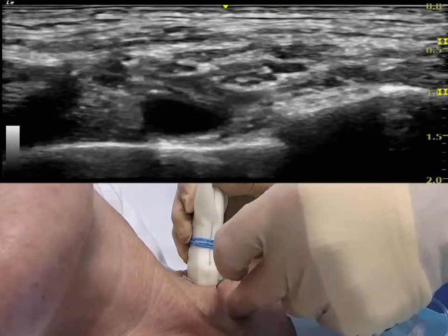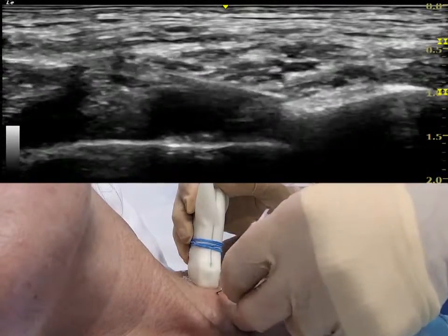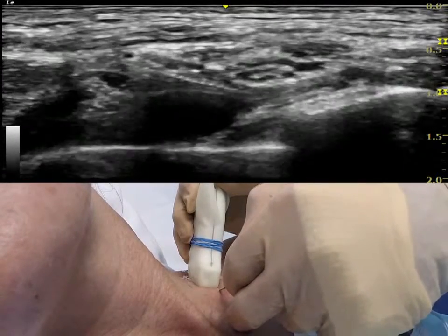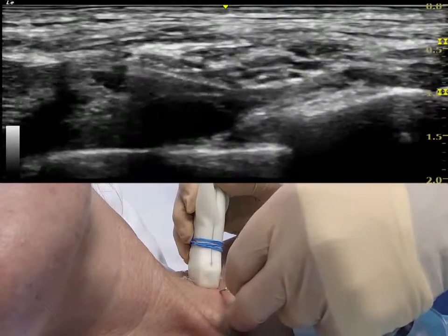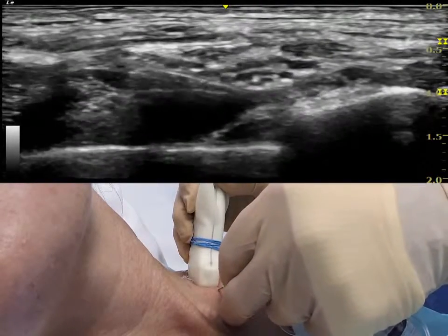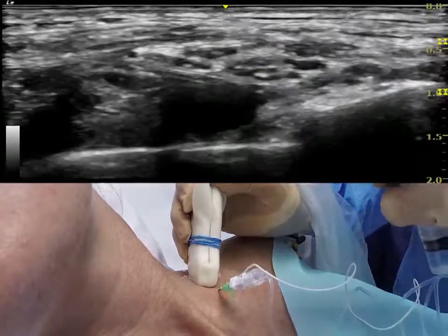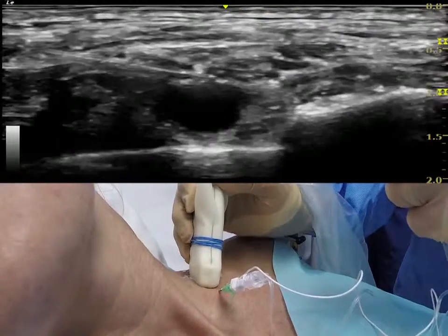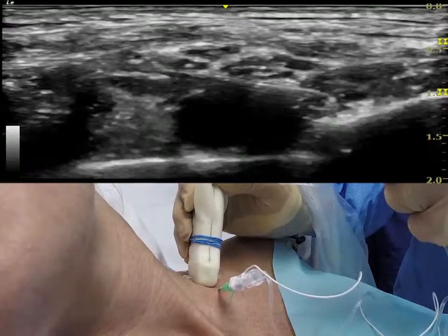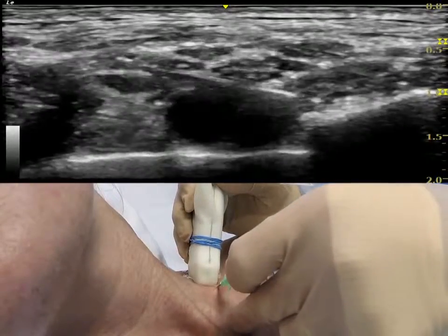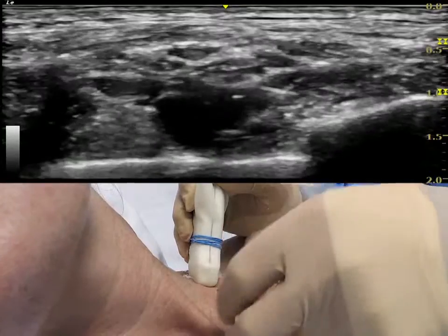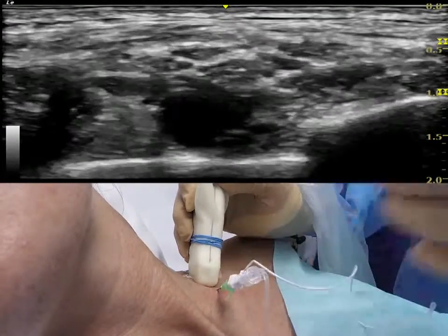The e-cath system makes the actual catheter insertion a very simple process. We can maintain the ultrasound image while the needle is withdrawn, the catheter is inserted and luer locked in place and the position is checked with a further local anaesthetic bolus.